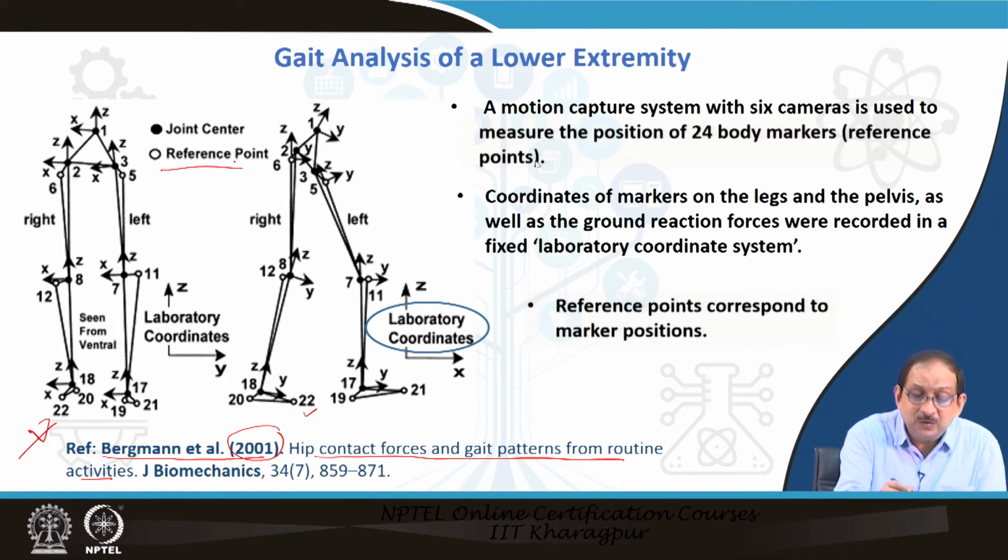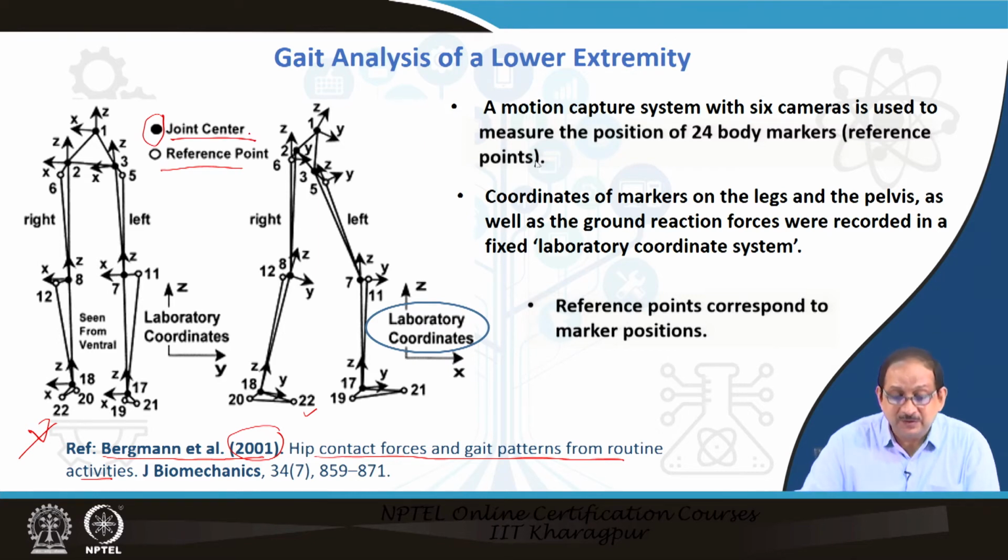There is another point which is indicated by full black circle, that is the joint center. So, in the figure as presented here in the slide, we can see reference points indicated by white circles and the joint center indicated by full black circles here and here as well.